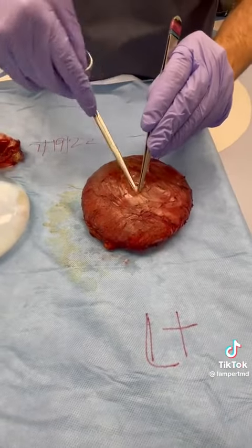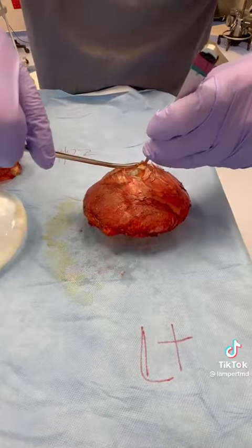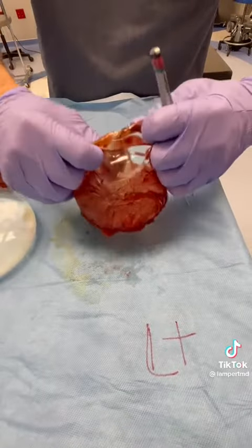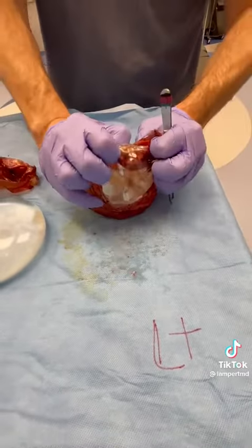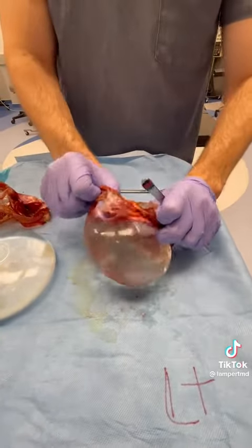Dry it up on the back table. We do this at the end because sometimes these are ruptured and we don't want any rupture inside or on the instruments. I don't want to hear it, I don't care — I'll pop it with a scissor and squirt the camera operator.